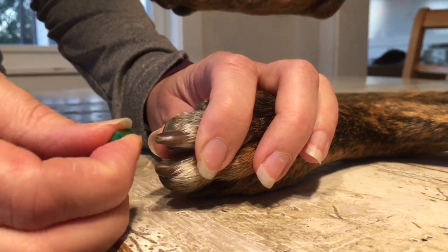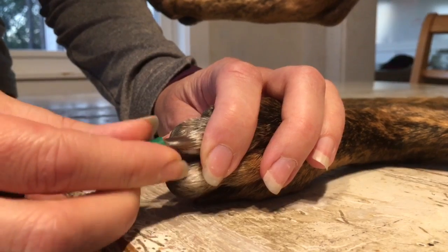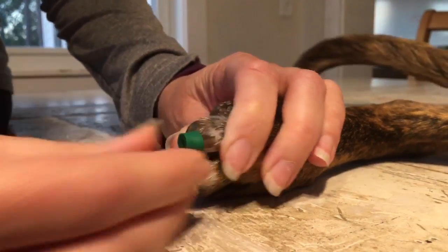So I stabilize, then I'm going to take my lubricated toe grip that had isopropyl alcohol on the grip, just to make it slide on a little easier. And I'm going to press it as far up the nail as I can.